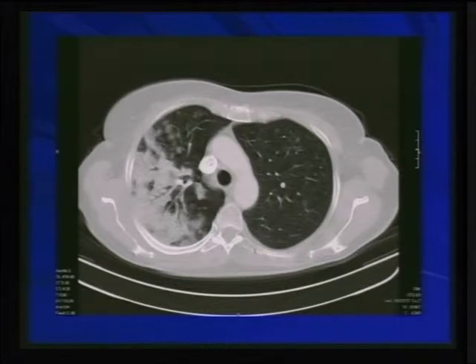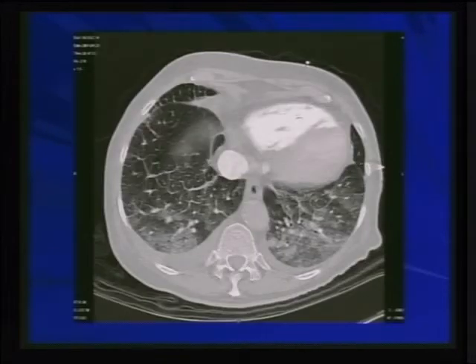And then after that, we're looking at the evolution, the patient's condition, the clinical condition. You can, as a radiologist, actually come up with a very precise diagnosis. This is an example. We don't do a CAT scan for pulmonary edema, but this is an example showing different degrees of pulmonary edema. You see the distribution: the patient is bedridden, so the edema is going to be in the dependent portion. You have this fluffy appearance of the secondary pulmonary lobule filled with airspace disease, but also you have this.